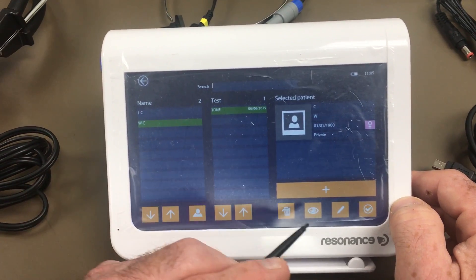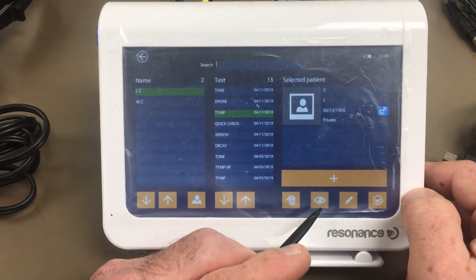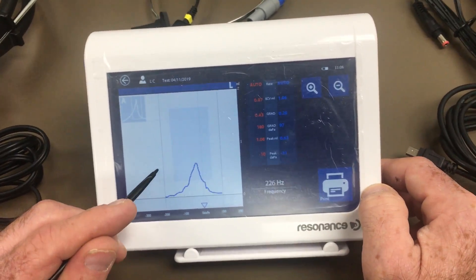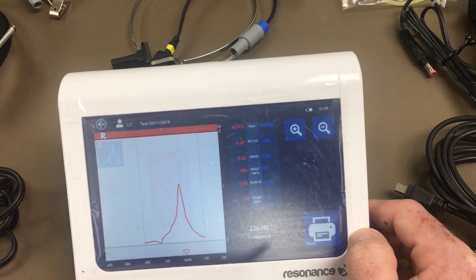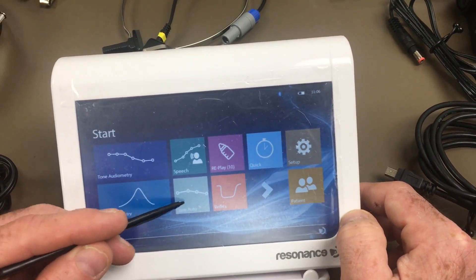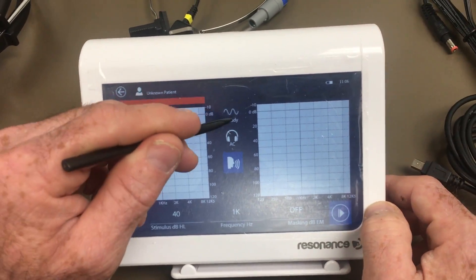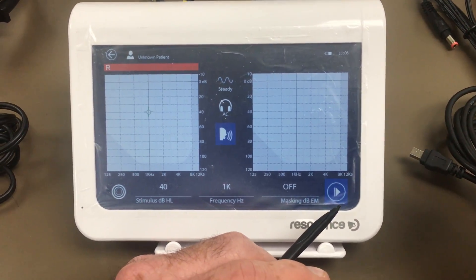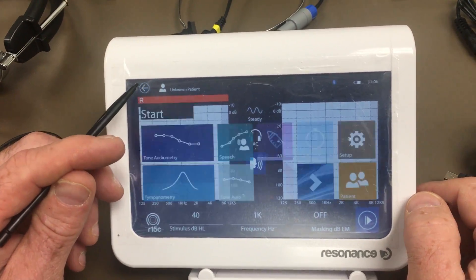Next is auto threshold, which is self-explanatory — it goes from left to right. You have AC and steady; you can't change those. When you're ready to start and the patient has the response button in hand and their headphones on, you just hit start.